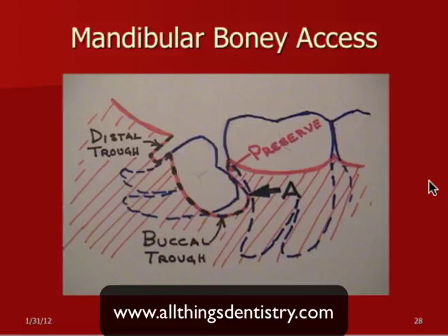I actually use both hand pieces, but for third molars, I typically like the Striker or the Osteomed surgical burrs. They have a lot more torque. They're a little longer, usually can get down into deep areas. But when I'm doing surgical extractions like end molars or bicuspids, I like the impact air. It has a lot less what we call collateral damage. You can preserve a lot more bone, and you can do a lot better job of trisecting a molar to extract it than you can with the Osteomed or the Striker.